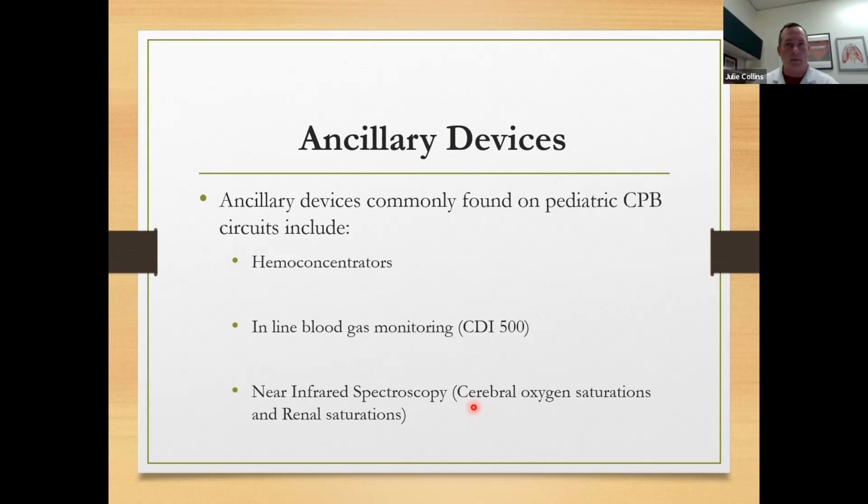So at Advocate, Perfusion puts the pads on. Kid comes in the room, I'm taking an alcohol swab, trying to get all that grease off their forehead. I wait X amount of seconds for the alcohol to dry, and then I make sure I get a good pad placement on the head. Places where anesthesia puts it on, maybe they don't pay as much attention to it, but I've dealt with it enough to know that the pad migrating can be an issue.